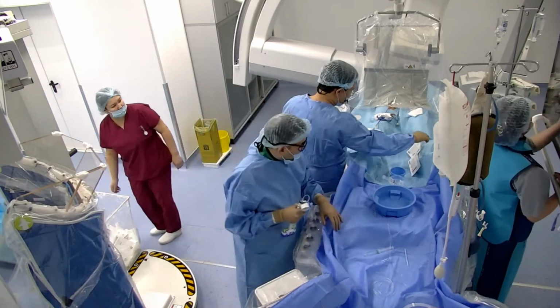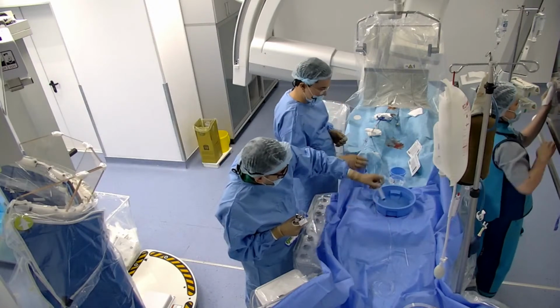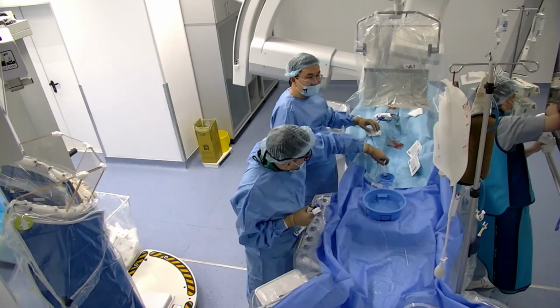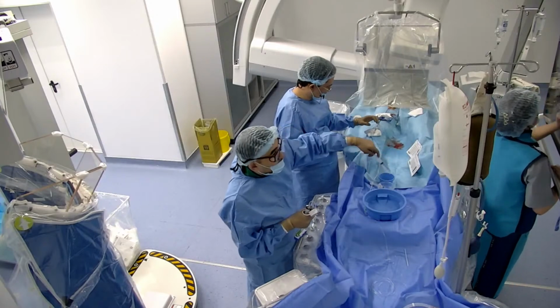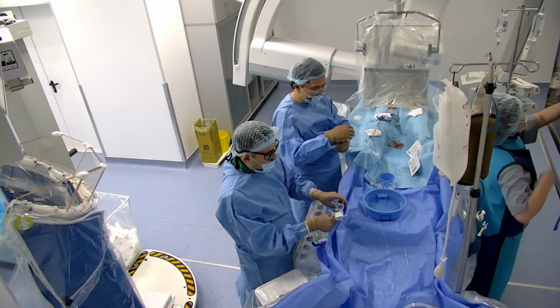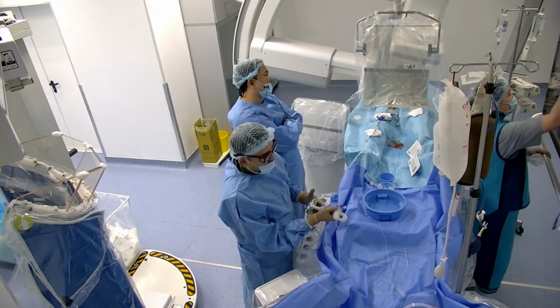Because of the syringe during the angiography, it's set from cardiology. Yes, there is a lot of problem with the material today, and this syringe was used for the angiography, and because of no luer lock, the contrast was leaking, and the screen is filled by contrast.